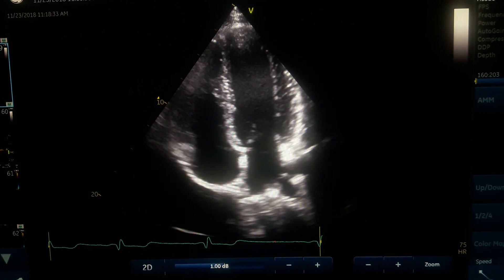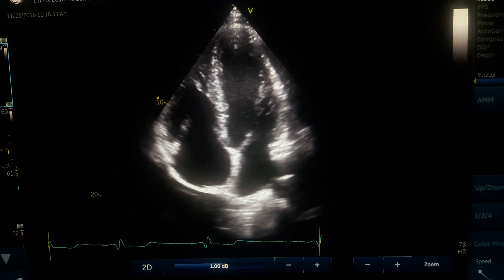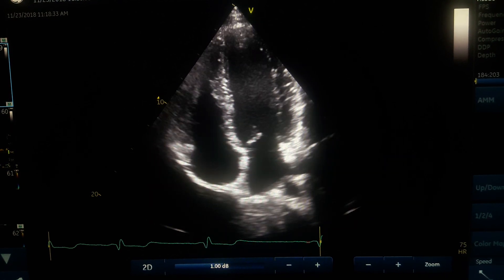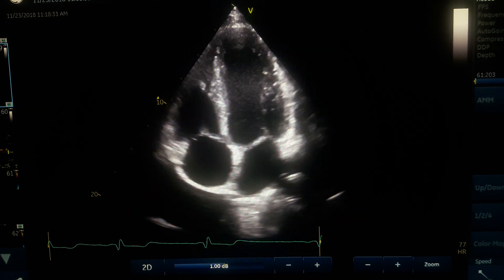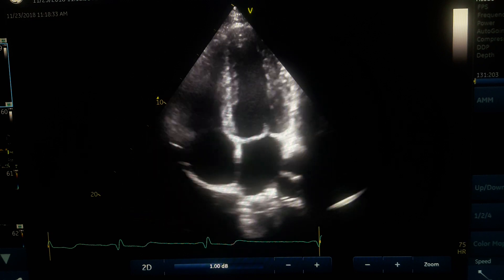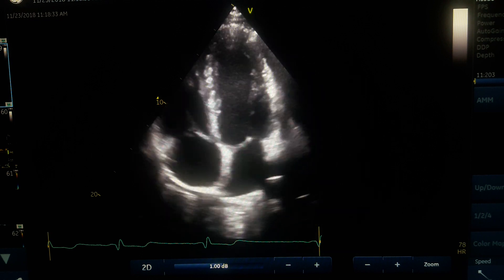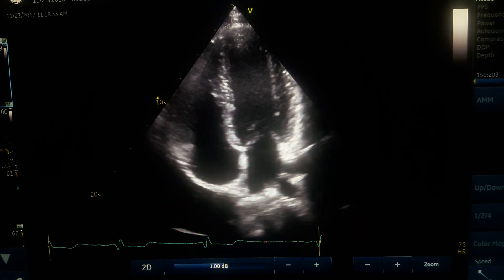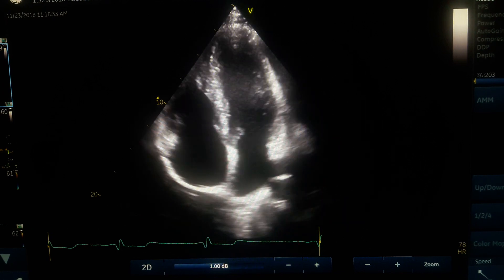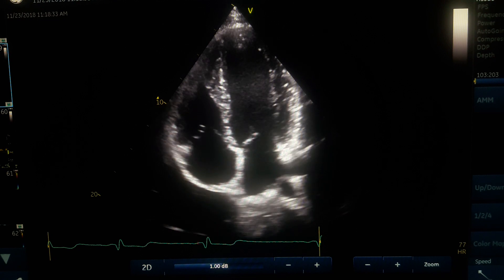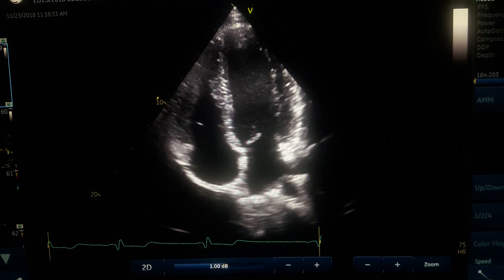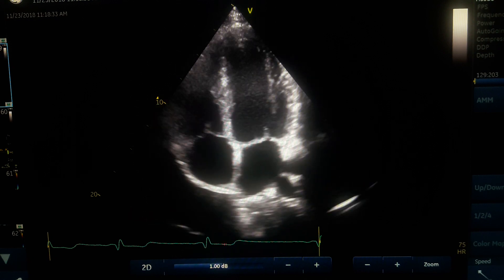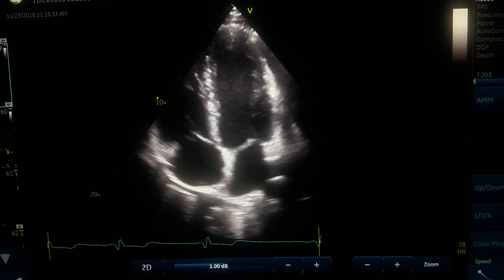MAPSE and TAPSE — mitral annular plane systolic excursion and tricuspid annular plane systolic excursion. During systole, the long axis becomes shorter, meaning the base of the heart moves forward toward the apex. If we measure this displacement of the base of the heart toward the apex, we can indirectly obtain a good indicator of left ventricular and right ventricular systolic function.